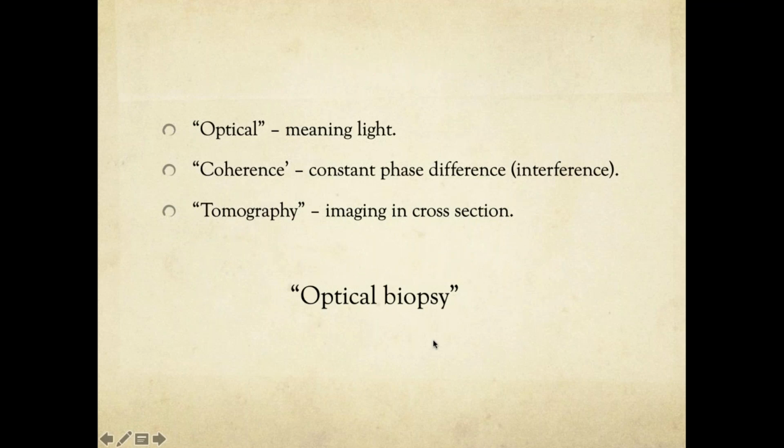Optical coherence tomography, it's basically an optical biopsy. It's a section, you take the sections of the retina, now even the choroid and the sclera. So why is it an optical biopsy?